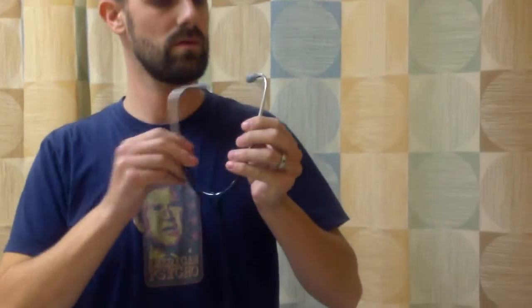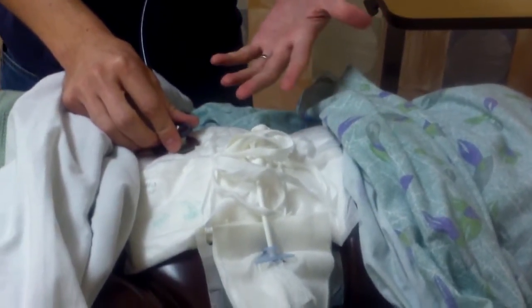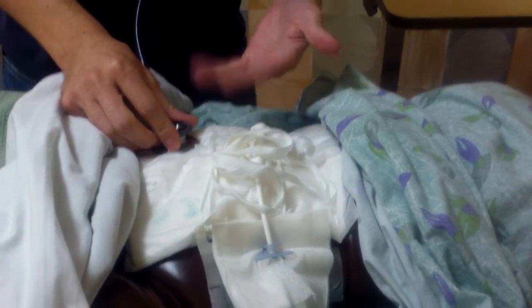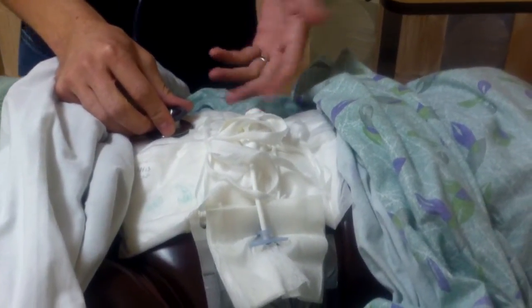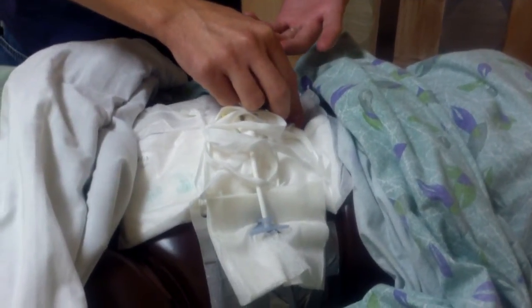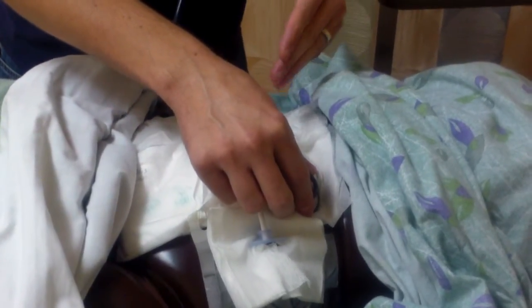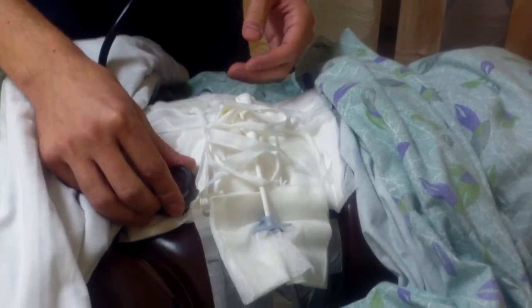Listen. Put these on right. Go this way. Alright, here's a diaphragm. Starting in the lower right quadrant here, I'm going to listen for any kind of bowel sounds, at least for 15 seconds. And once I hear some good active bowel sounds, I'll move on to the next quadrant. Now, if I didn't hear any bowel sounds, I would listen for a full minute in each quadrant, or 5 minutes total. Okay, this is good. Making sure it's not hyperactive or hypoactive.